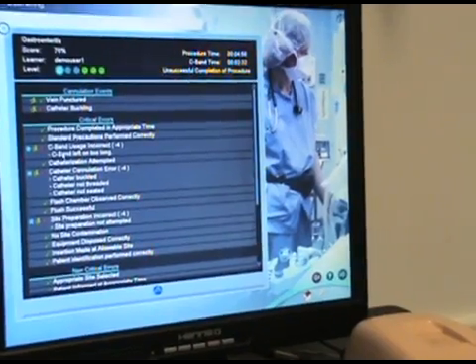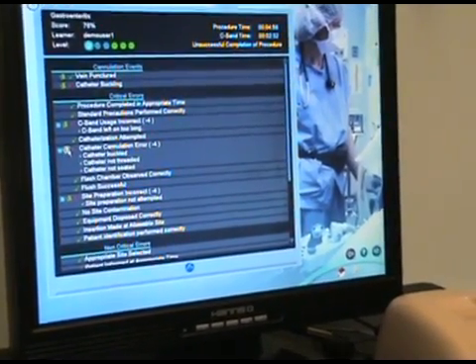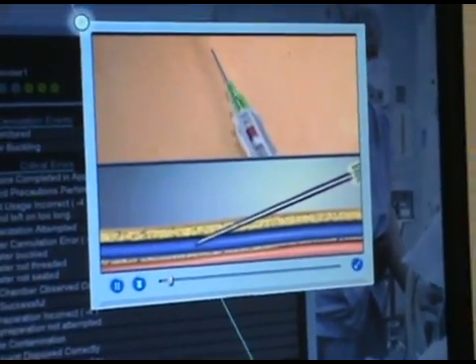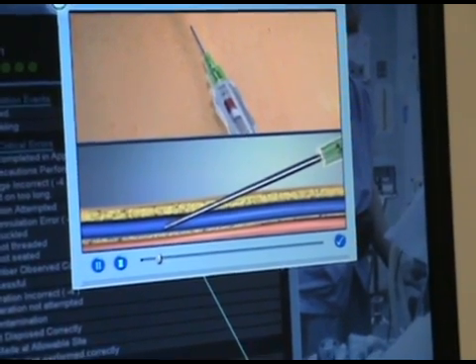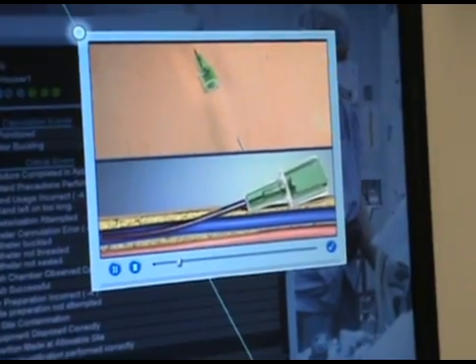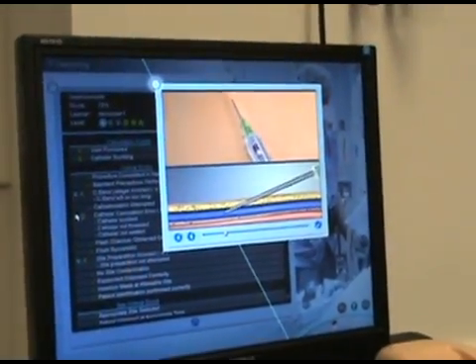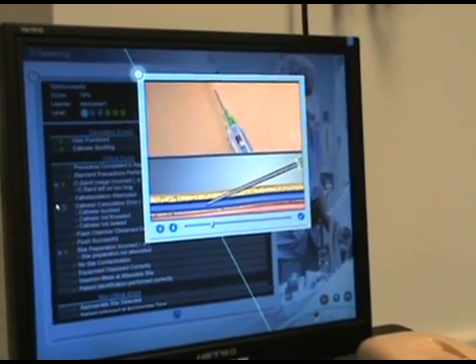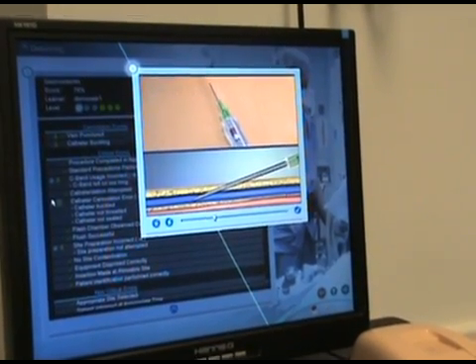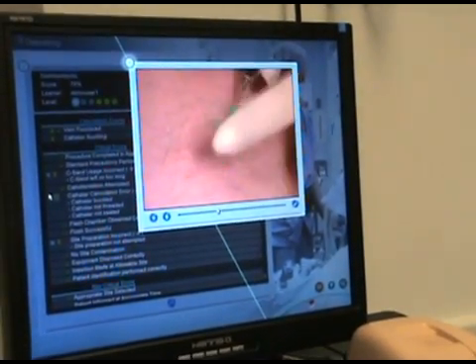Another issue: the tourniquet wasn't removed in time. Also, there was a catheter cannulation error. Correct IV catheter cannulation means penetrating your vein with the needle, seeing the IV catheter inside the vein, threading the catheter into the vein while holding the needle still, and finally removing the needle. Once a blood flash is observed, advance the IV catheter slightly to ensure it is in the vein, then fully advance the catheter.